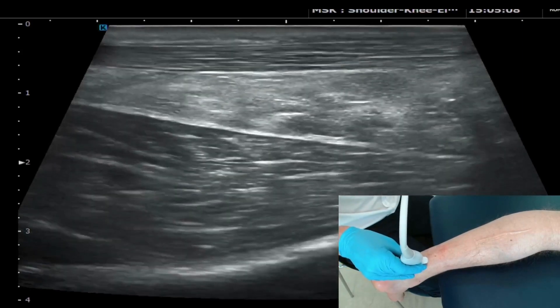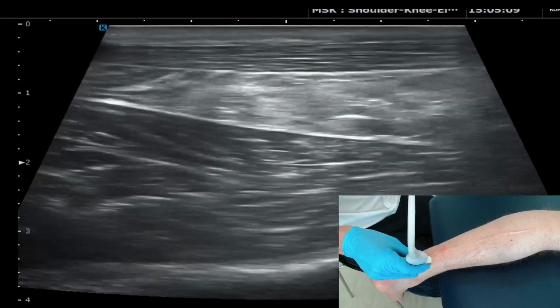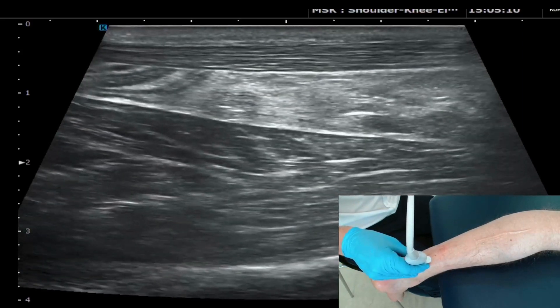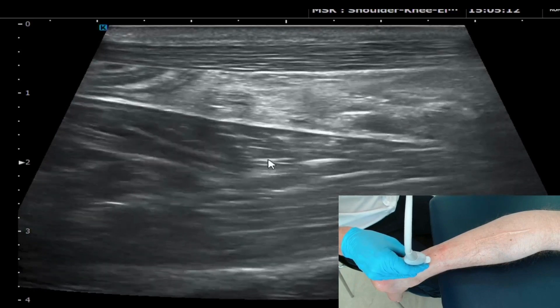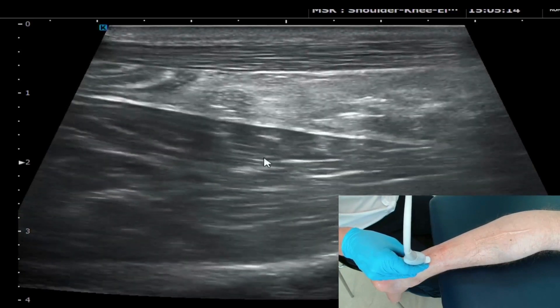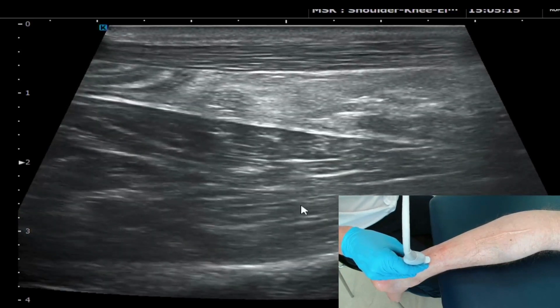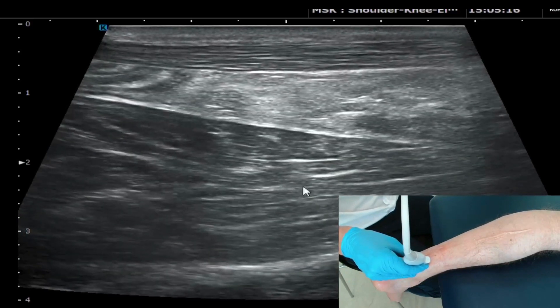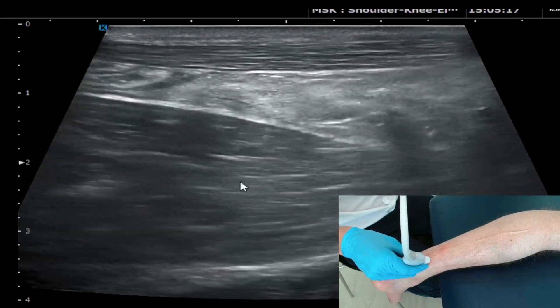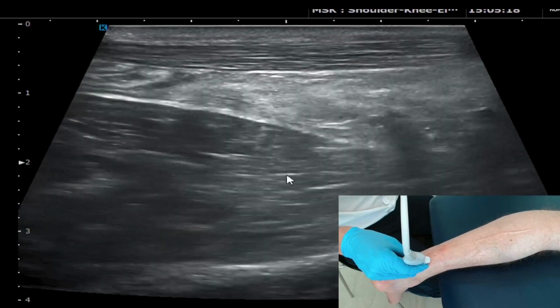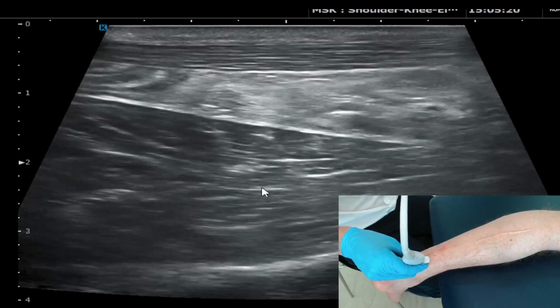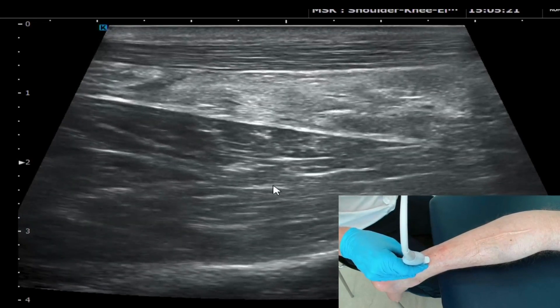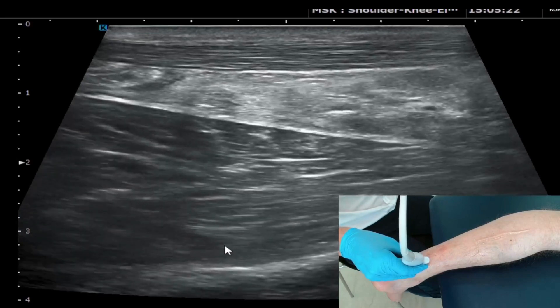Coming up a little bit further proximal, you'll start to see there's a large muscle deep to the Kager's fat pad — this is the flexor hallucis longus muscle, which ultimately changes into tendon or has a musculotendinous junction around the back of the ankle.